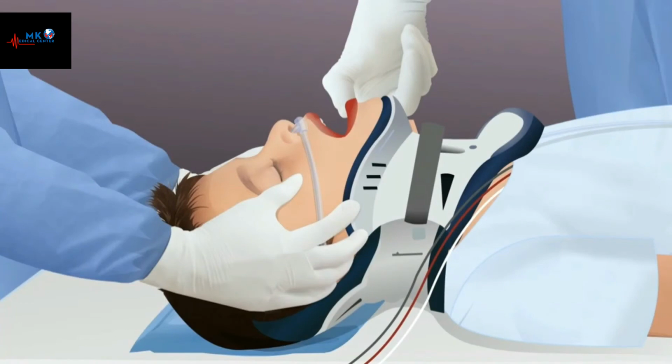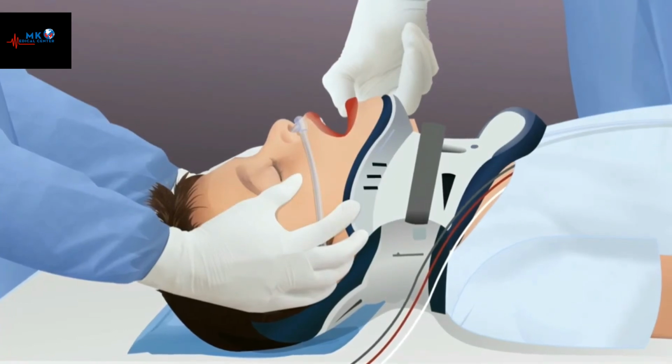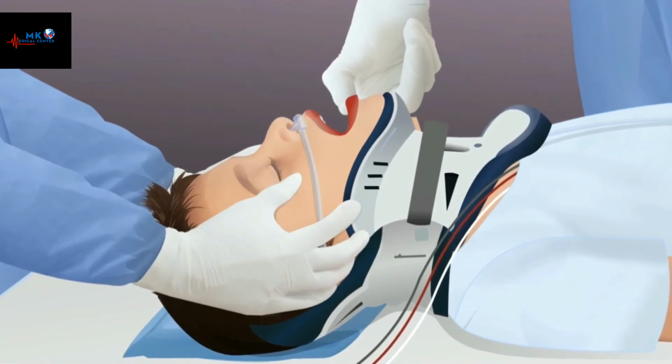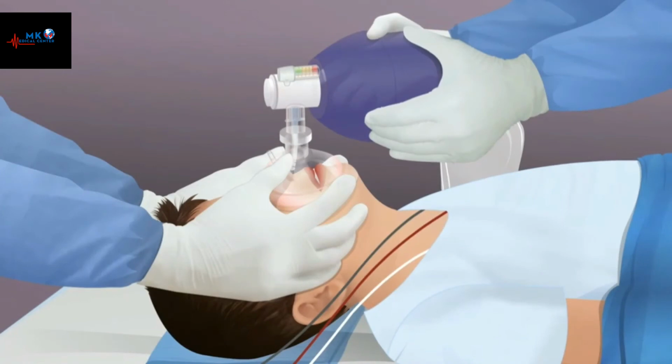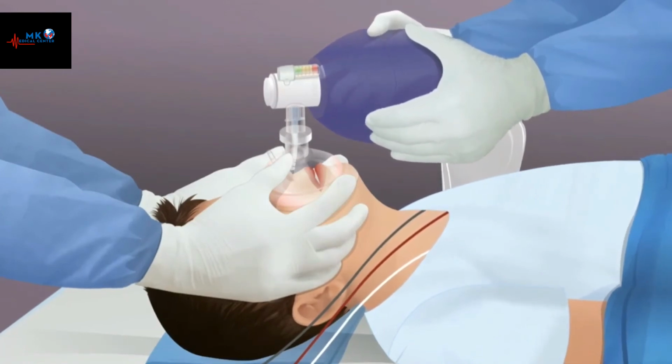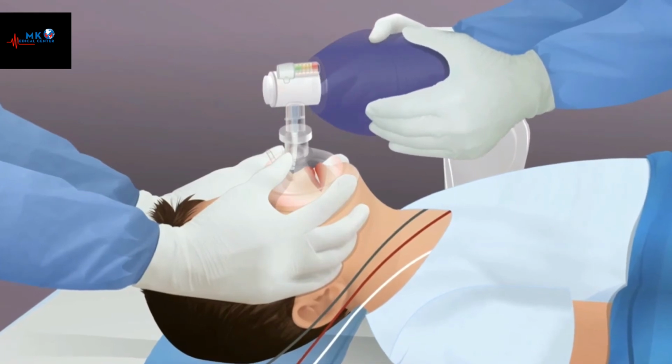Child with suspected or confirmed spinal cord injury: maintain the head in a neutral position with inline cervical spine immobilization. Open the airway and, using a bag mask device attached to an oxygen source, administer a sufficient volume of oxygen to ensure chest rise.